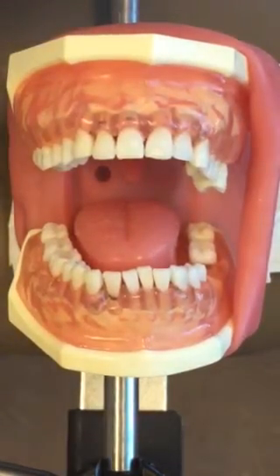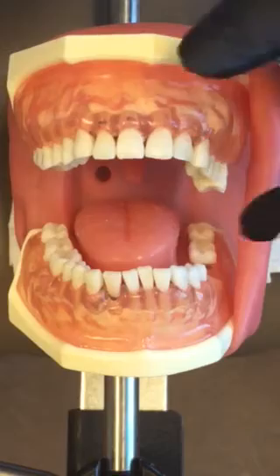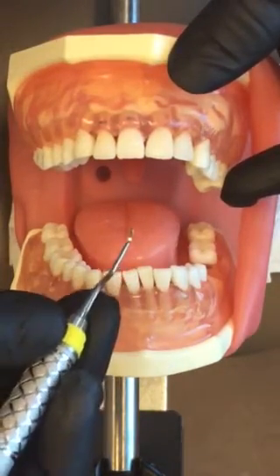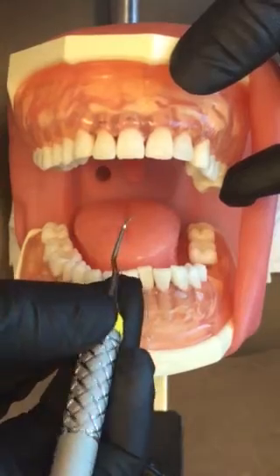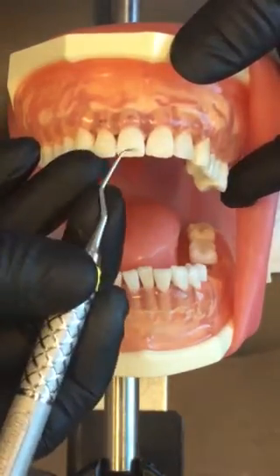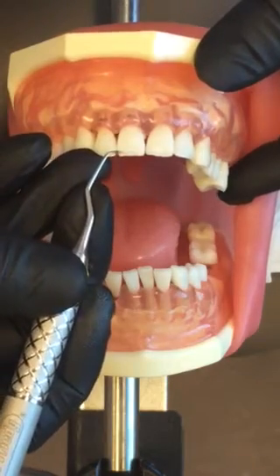Your Gracie 1-2 is an area specific curette used for anteriors only. You're going to look at your curette and see which blade is lower in order to determine which end is going to work for surfaces towards you and which end is going to work for surfaces away.